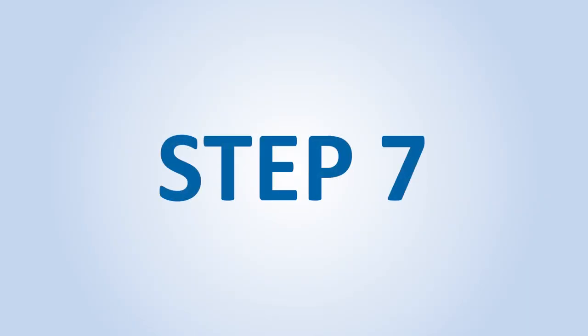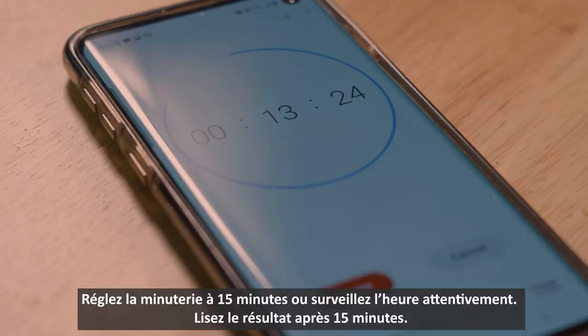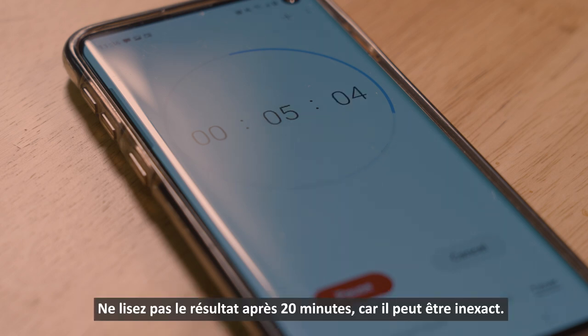Step 7. Set a timer for 15 minutes or watch the clock carefully. Read your result at 15 minutes. Do not read results after 20 minutes as they can be inaccurate.